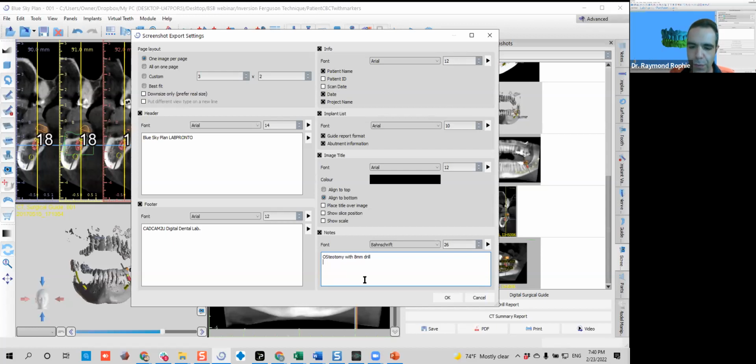This will be for me to remember it, right? And then here, placement with variable height driver. For example, I use the variable height driver up to the second mark. The second mark on the variable height driver, it's the same offset changes from 8 to 10 to 12.5.